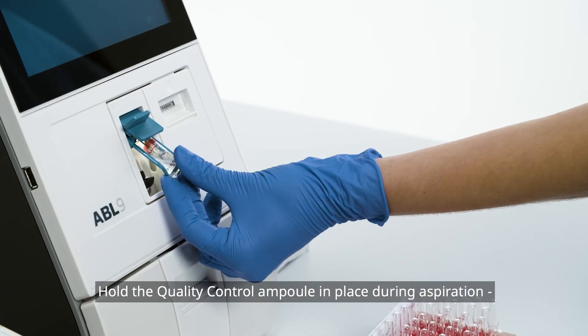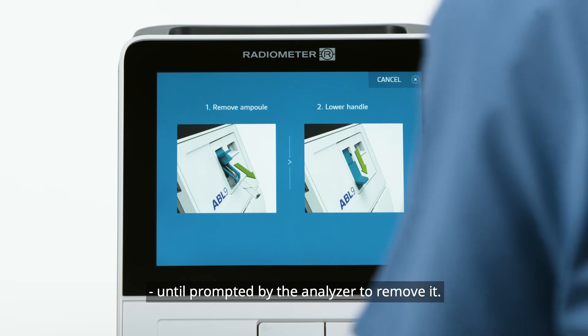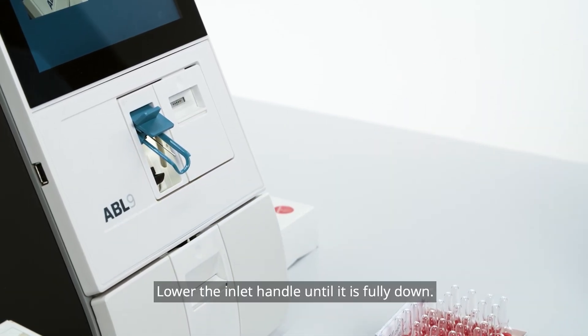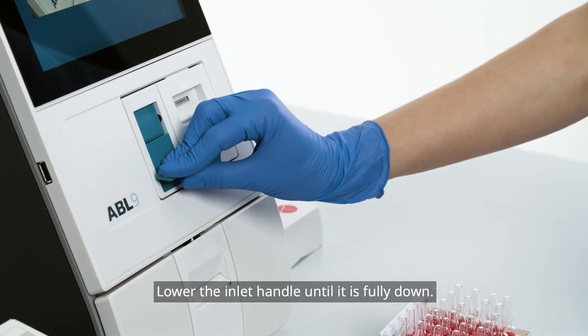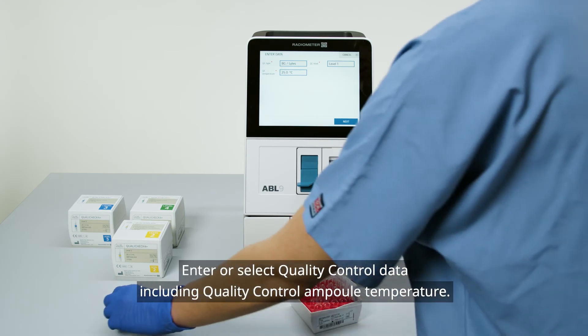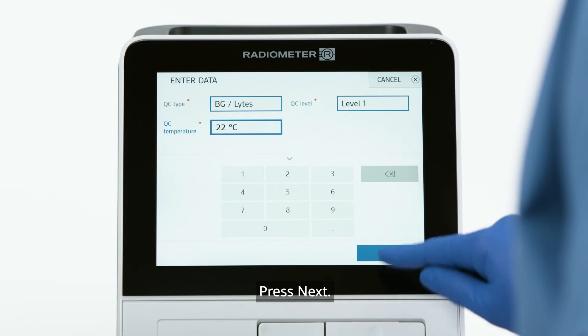Hold the quality control ampoule in place during aspiration until prompted by the analyzer to remove it. Lower the inlet handle until it is fully down. Enter or select quality control data including quality control ampoule temperature. Press Next.